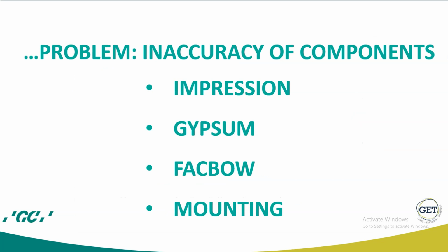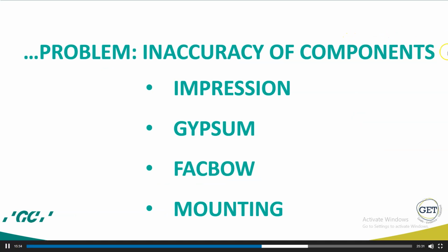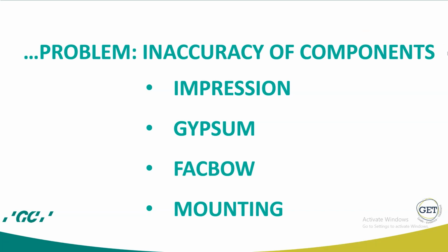Evidence-based dentistry will probably never settle the use of articulators in orthodontics. We experience a higher than acceptable amount of errors when transferring casts between articulators. We see problems especially in the inaccuracy of the components: the impression, the gypsum, the facebow itself, and the mounting.